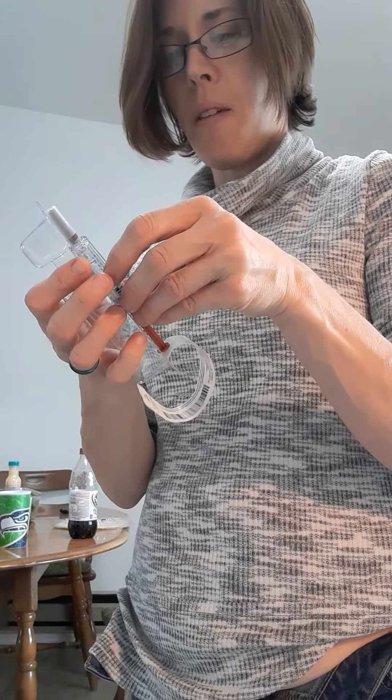So first of all, what we're going to do is take the alcohol to sanitize, to make sure the skin is clean.